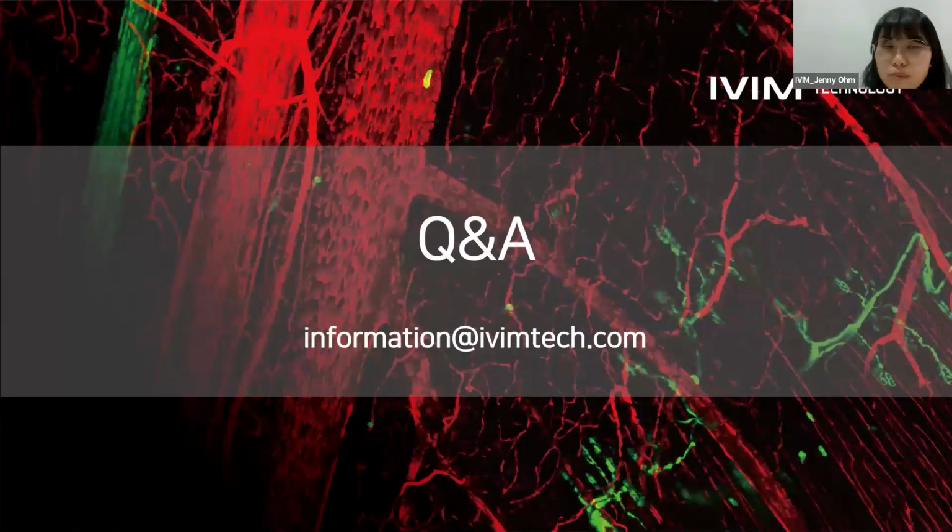For example, for the brain, you can image brain areas such as the cortex using the confocal laser, but if you would like to image much deeper, then the two-photon laser would be much more helpful, as it has a longer wavelength, which allows it to penetrate into much deeper areas of the organ. So for deep brain imaging, the two-photon laser would also be very useful. And generally, if you would like to image deeper areas, not only in the brain but in other organs, using the two-photon laser would be a very useful option as well.